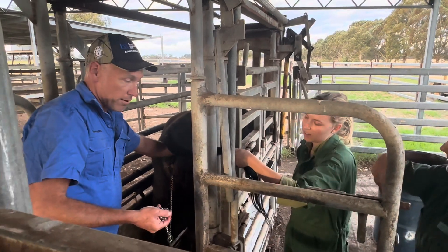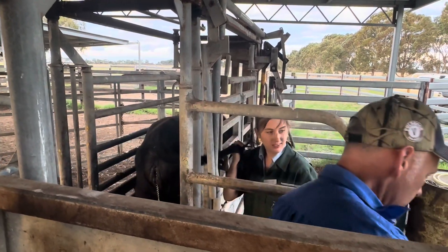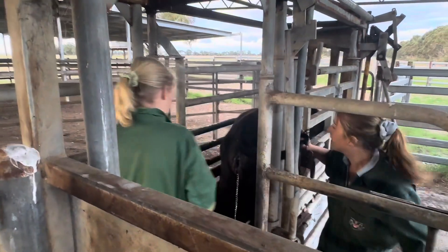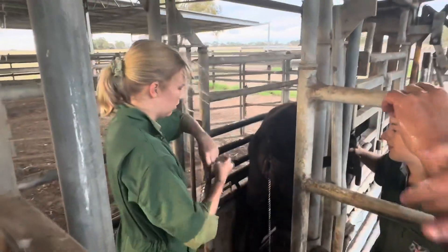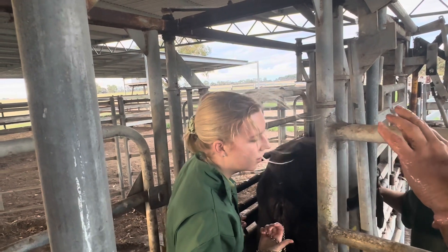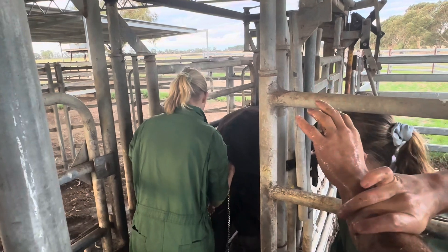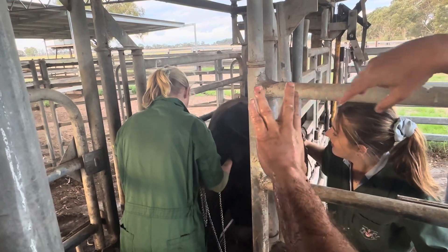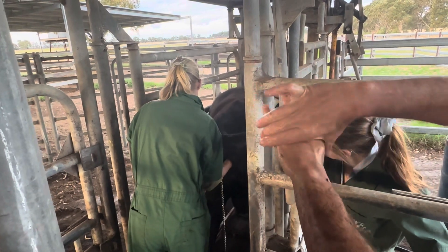So the arm is up to the right. You want to feed this up over that rope and then throw a half hitch over it. Don't push the nose. Alright, so did you see I put the chain on there, Craig? So the idea is, like this is the fetlock — you want to put that in the thin part of the arm. Because right down here at the bottom is where the growth plate is. If you pull down there, you can pop that growth plate, which is bad. So go above the fetlock — there's a little bit of a narrowing. What tends to happen is if you're struggling to get it on, it slides down to that dangerous spot. Keep it up there, and then you throw a half hitch with these little hooves. And that's a dewclaw. Put the next part of the chain right there, and when it does, it spreads that force out so you don't break a leg.